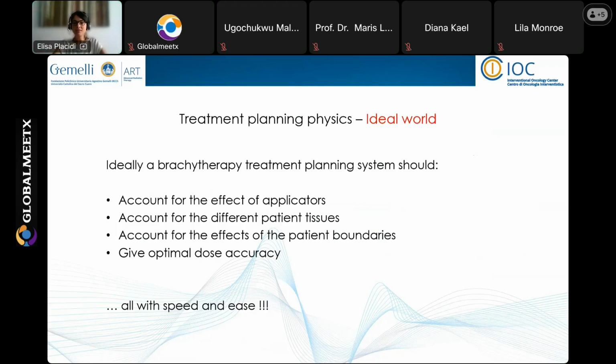But for brachytherapy, we implant a cervical applicator, an intrauterine applicator, and then the patient, of course, stays there and waits for the treatment. So we really have to be quick. All of this needs to be very quick, so the simulations need to be performed as soon as possible.